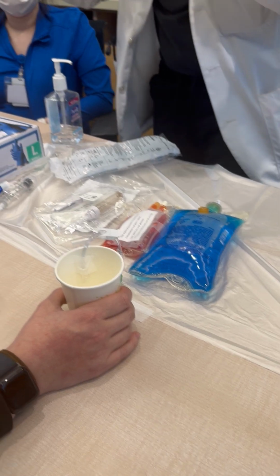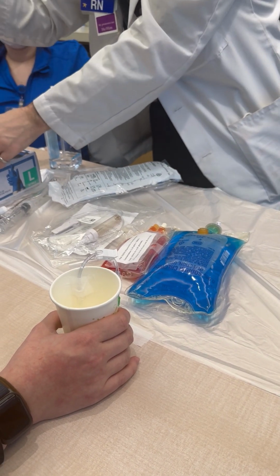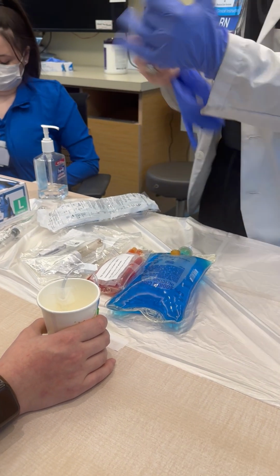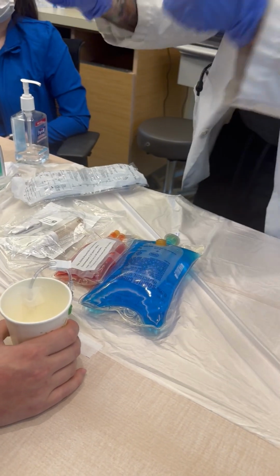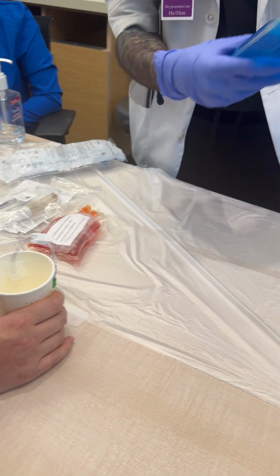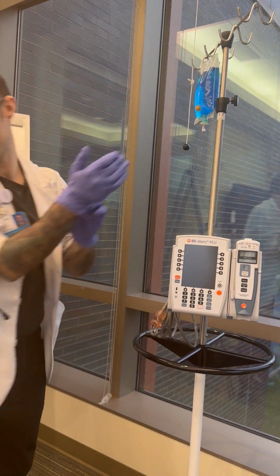I already did hand hygiene, so for the sake of the video, I didn't touch all that stuff. I'm just gonna go right back to doing what I was doing here. Put on my gloves. I just don't want to stain my coat with blue 40. So I'll go ahead and hang this first.